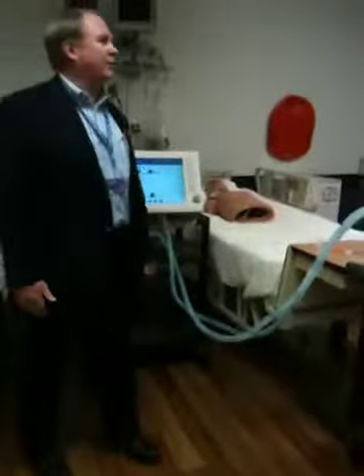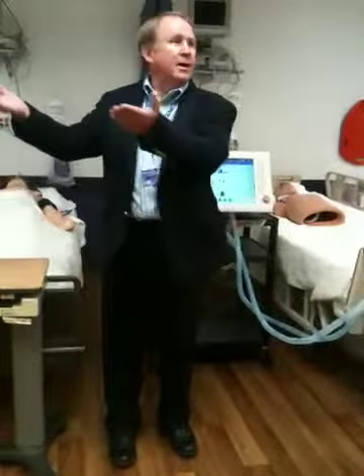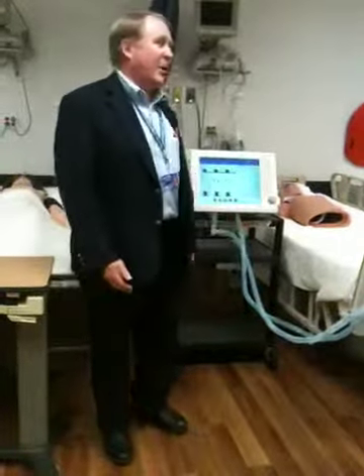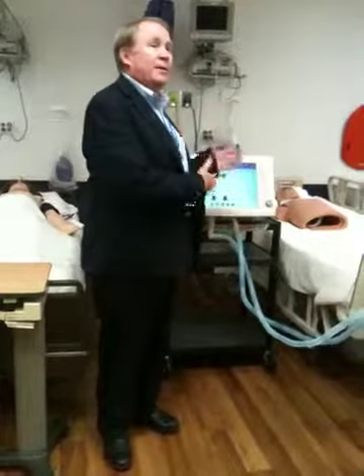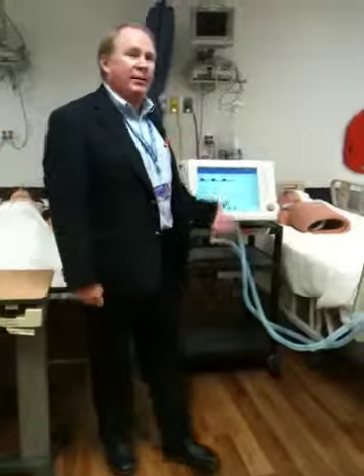I want to know that, because before I take them off and say, oh yeah, doc, he can come off, he's doing 80% of the work. Yeah, he does 100% for 80% of the time, and 20% of the time doesn't breathe at all. Well, I need to know that. So I can look at the trend data. That way I don't have to be there all the time, and it tells me what happened in the past. It also tells me if somebody's changed my dials.